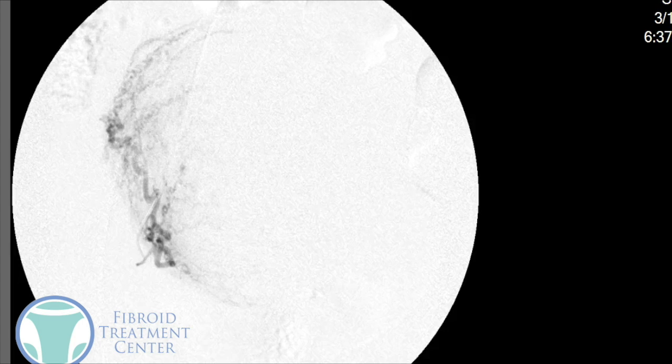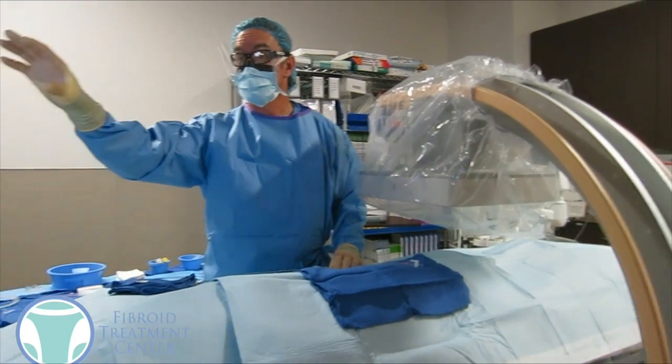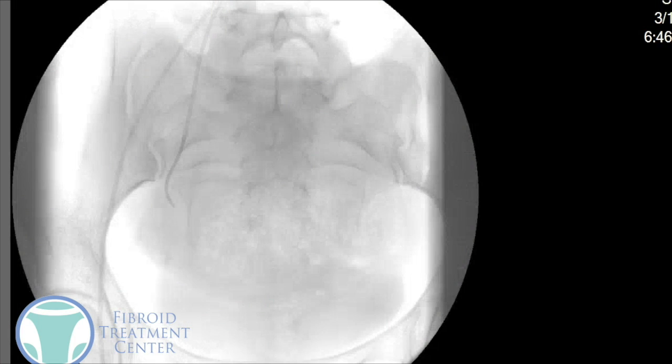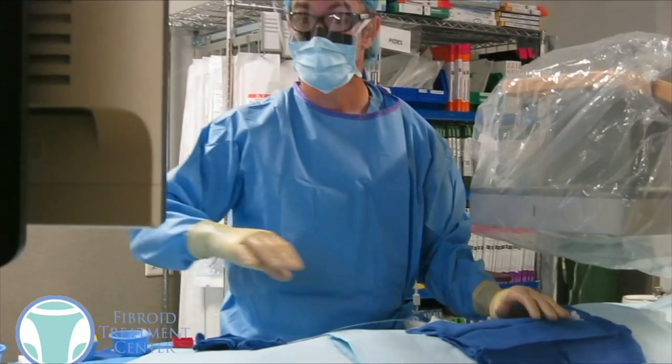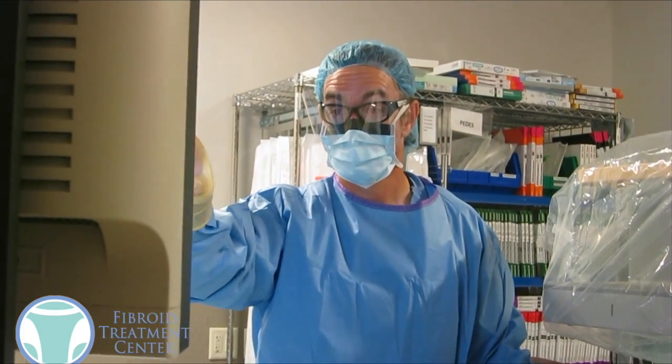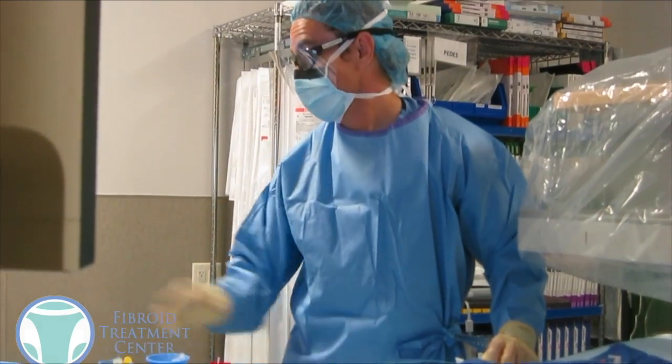We'll definitely want to embolize this side because we won't want the fibroid to come back or the bleeding to continue — only doing the left side would only be half treatment. Once we're in the correct position, which we confirm with this x-ray, we're going to take those same little microscopic particles and inject them through the catheter, then flush the catheter out and shut down the blood supply to the right side of that fibroid. We'll take another final x-ray, and as you can see, there's no more flow into the right half of that fibroid. No more flow into the fibroid — we've done the left side and we've done the right side.